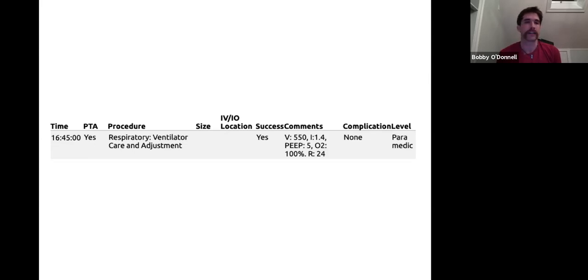But the patient that's been intubated for 4 or 5 hours, you get that at 3 a.m. and there's only one RT on, you should be able to handle that and take whoever they give you, whether it's the tech or the nurse. We're trying to avoid it because hospitals are starting to become frustrated when we pull their only respiratory therapist and take them to Dartmouth and they're gone for a couple hours. That puts them in a tough spot, and we have our own ventilators for that reason.